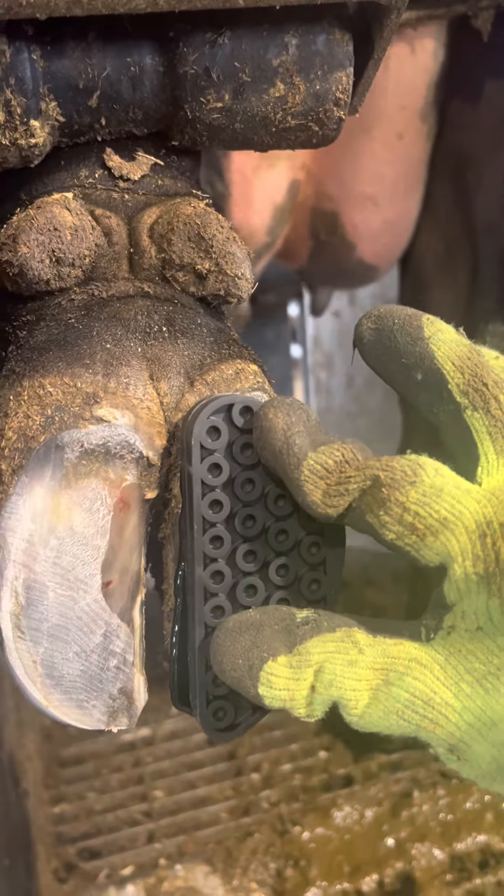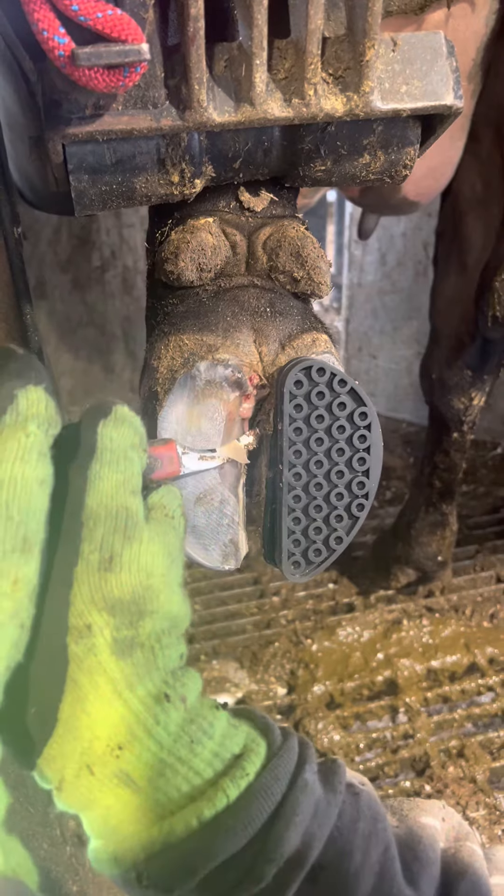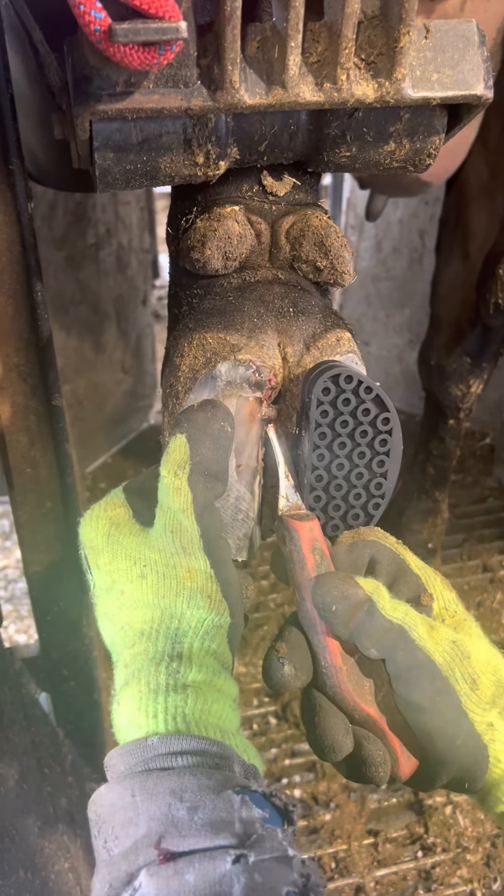Now that the block's on, we can start working on that bad claw. I'm trying to go slow and smooth so as not to cause the cow any further discomfort or pain.